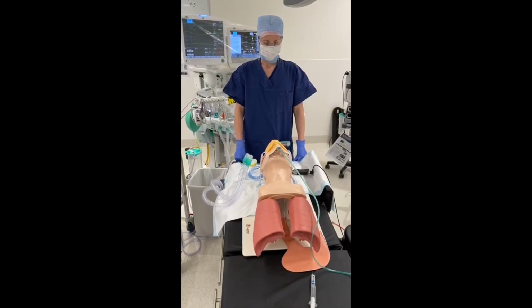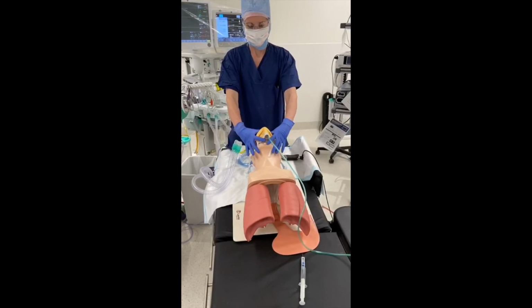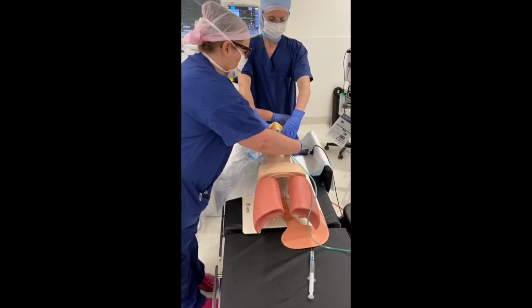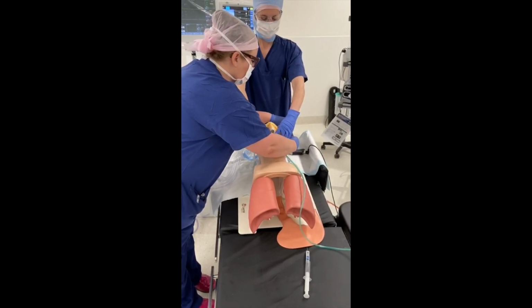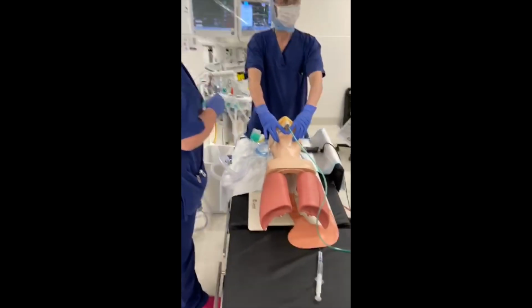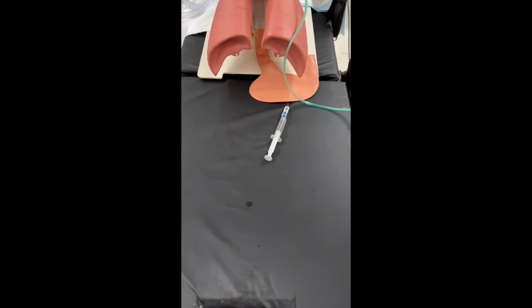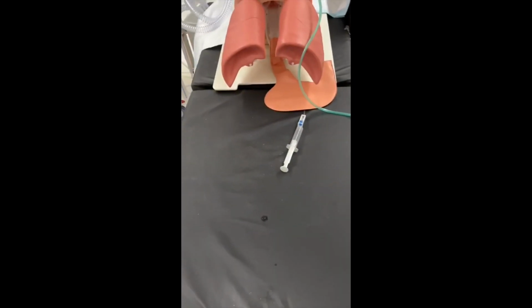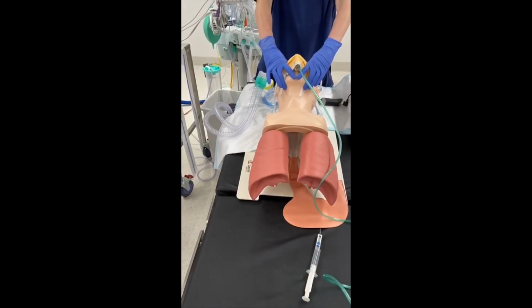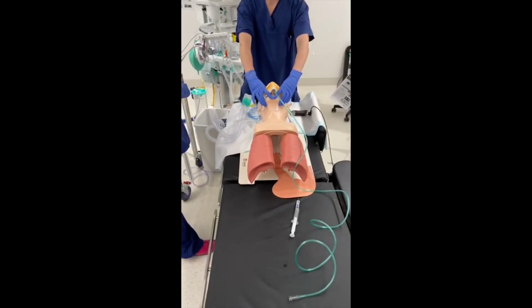Airway doctor holds the Hudson mask. Airway nurse, now cut the ties to the surgical mask and the Hudson mask, but leave the Hudson mask in place. I will now instruct you on how to remove the Hudson mask and replace the face mask. The sequence will be, I will turn off and disconnect the O2 tubing. I will then instruct the anaesthetic nurse to remove the Hudson mask and surgical mask and discard into a bin. And I will then instruct the anaesthetic doctor to place the face mask onto the patient's face. The sequence will now begin.